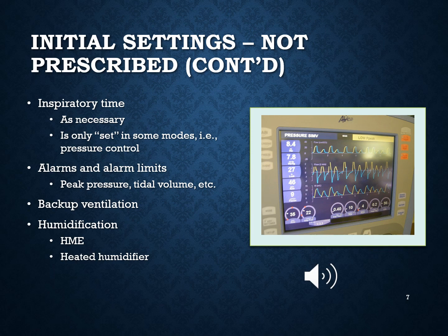So, for instance, if you were weaning a patient that was previously on an SIMV mode of ventilation with the rate of 10, tidal volume of 500, PEEP of 5, 30% FiO2, and you change the mode over to a CPAP mode for the patient to do all the work of breathing. Basically, you're just assisting the patient at the minimum level.